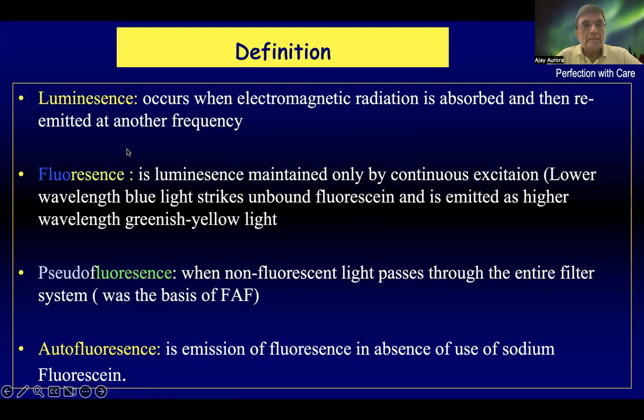What is luminescence? Luminescence is when an electromagnetic radiation is absorbed by a substance and emitted at another frequency. Fluorescence is luminescence which is maintained by continuous excitation.